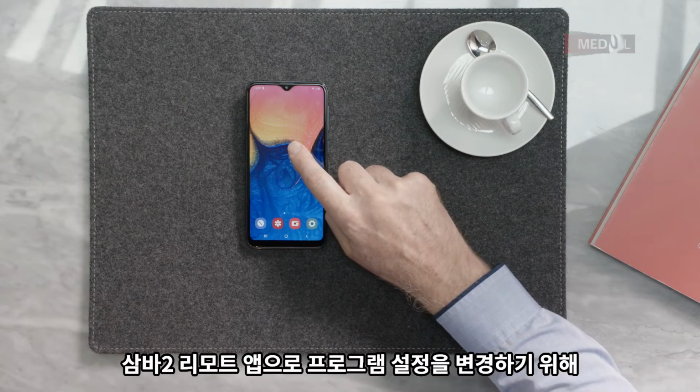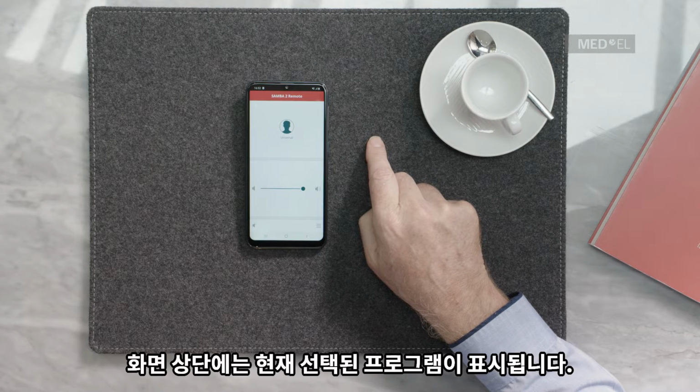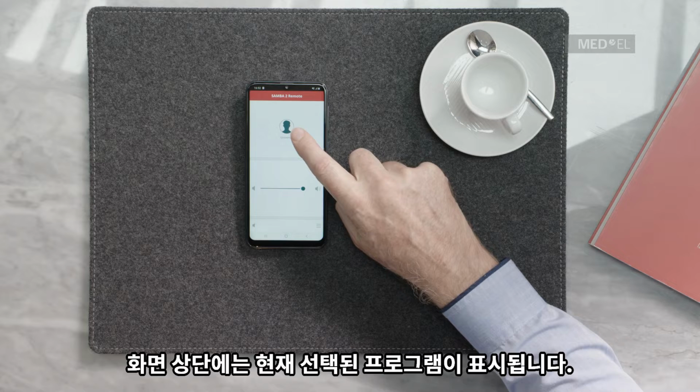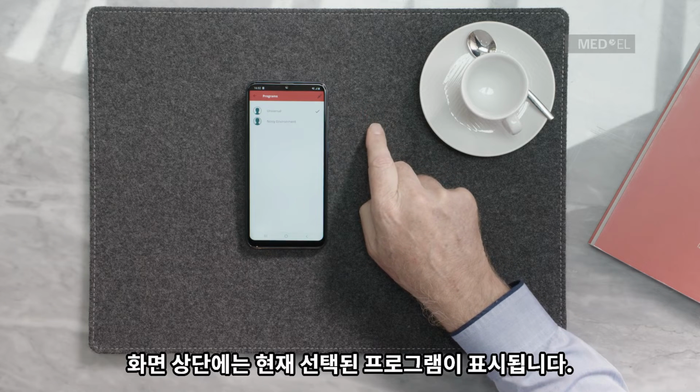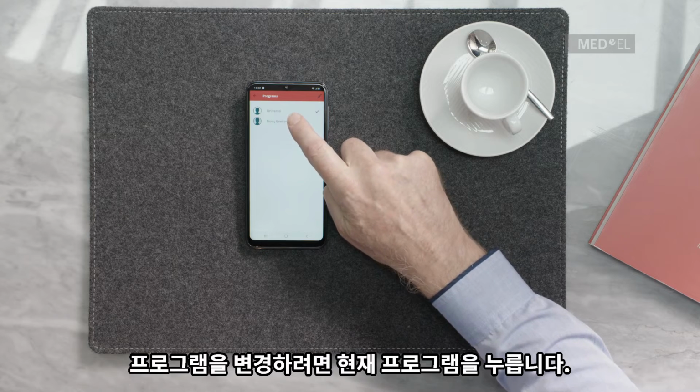To change program with the SAMBA2 remote, first open the app. The top half of the screen shows which program is currently selected. To change the program, tap on the current program.